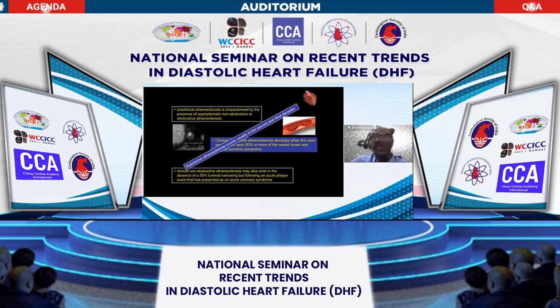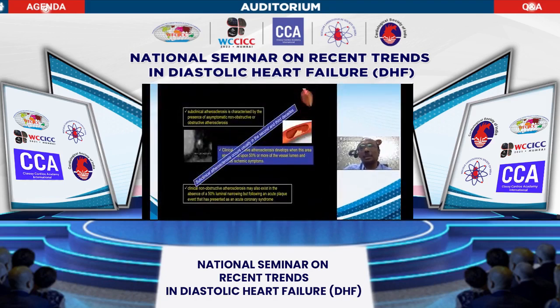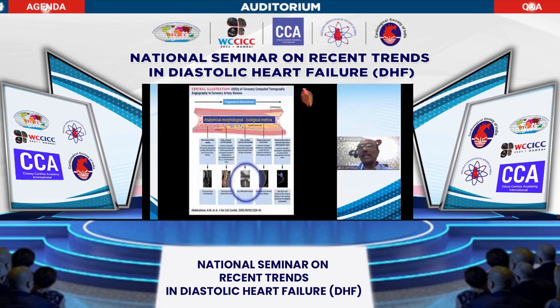The subclinical atherosclerosis, I think, is a physiological process, and generally in normal individuals who are not otherwise hereditarily predisposed, usually starts around the second or third decade. So starting as an anatomical imaging tool, we have progressed to morphology, and now we are looking at biological metrics as far as CT coronary angiogram is concerned. And I will highlight some of the important things where we have started to look at physiology rather than our preoccupation with the stenotic disease.